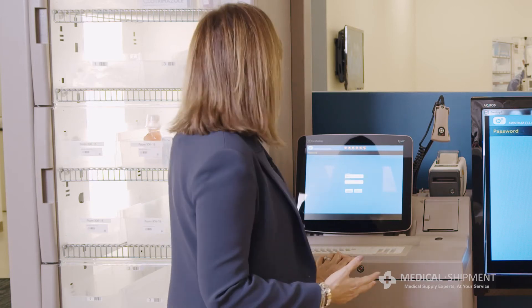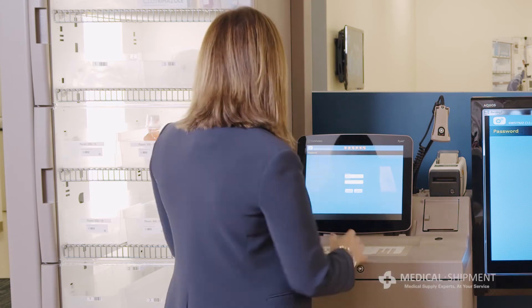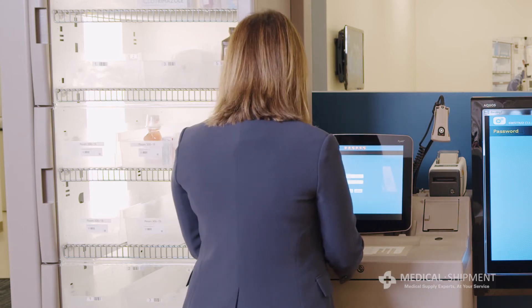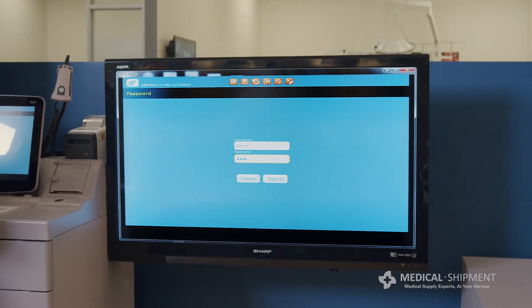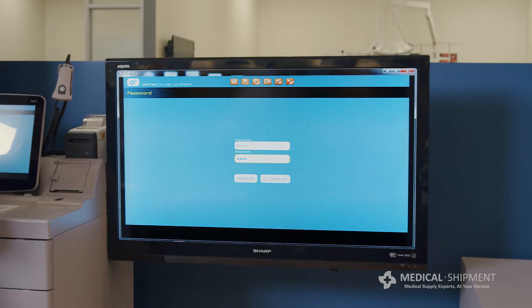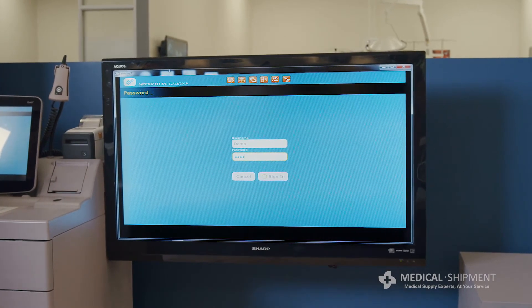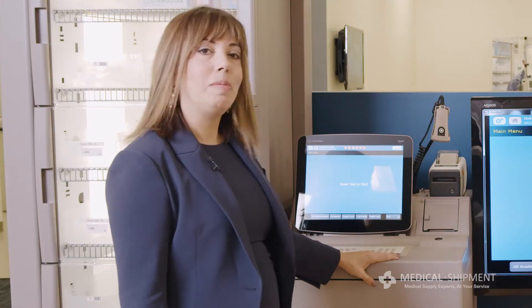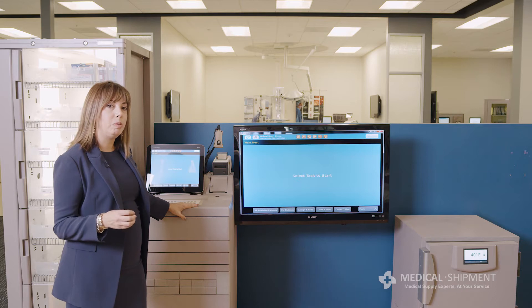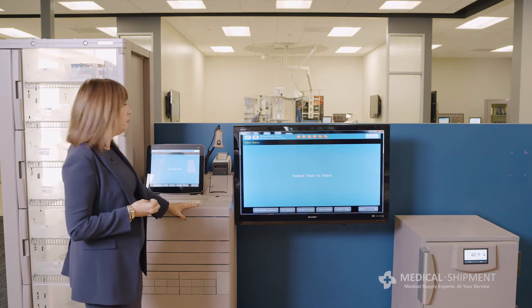Let's sign into the Pixis MedStation and look at some of the touch screen features and keyboard attributes. I've got the login ready to go. I'm going to use the keyboard to enter in my password and click on sign in. I'm going to sign into the Pixis and just go through some general information that's available through the touch screen as well as the keyboard.